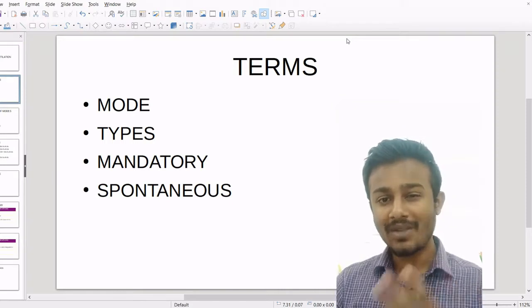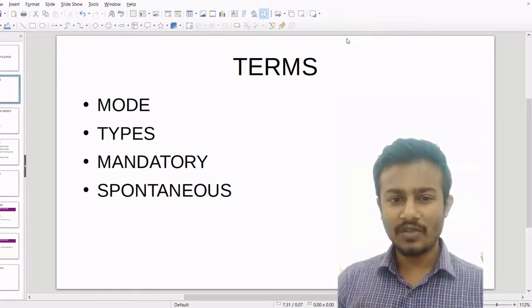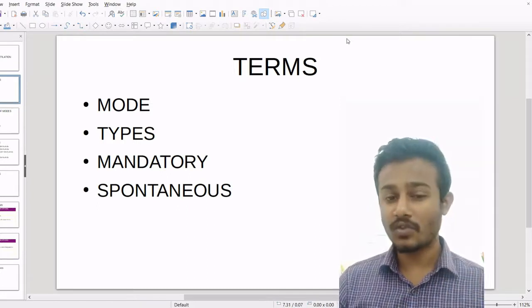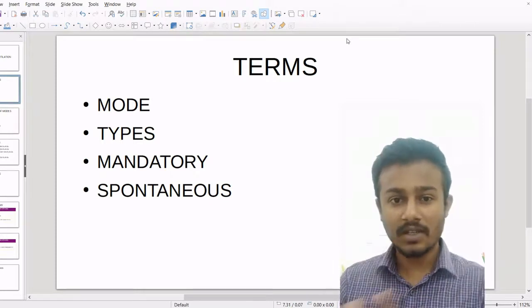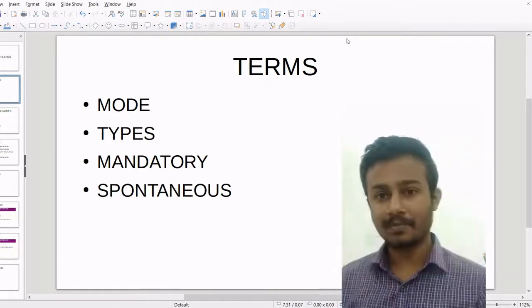So you have three modes. Basically, we have three modes of ventilation which we actually give the patient, and then in each of them we have another three subtypes. Okay, so depending upon the variable which we are keeping constant, which we are presetting, we have various types in those modes. So it becomes a 3x3 type of configuration. So we have three modes, under them we have three types, so it becomes totally 9 types of ventilation.